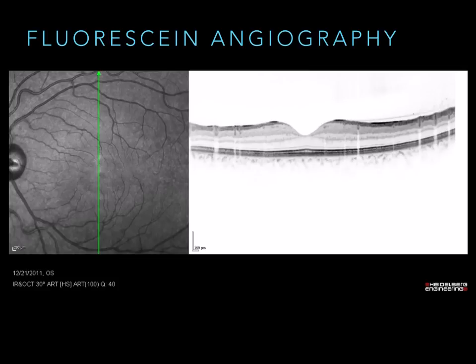We're going to talk about fluorescein, but I'm going to explain it with OCT to some degree. The retina has a dual blood supply. We went over this in my previous lecture last week. Basically, when you talk about the inner retinal blood barrier and the outer retinal blood barrier, these apply to fluorescein. And unless there's something wrong with the retina, which is why we all are interested in retina. If the retina was always normal, it wouldn't be that interesting. If there's something wrong with it, then things are going to leak through.